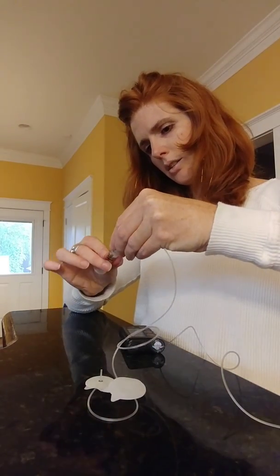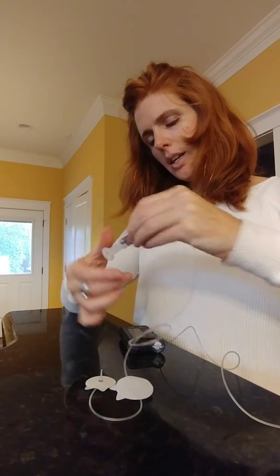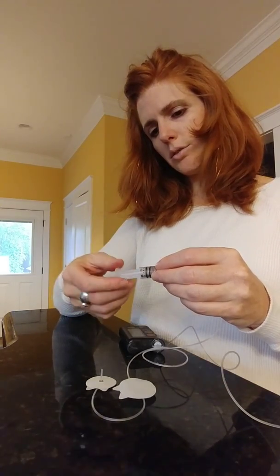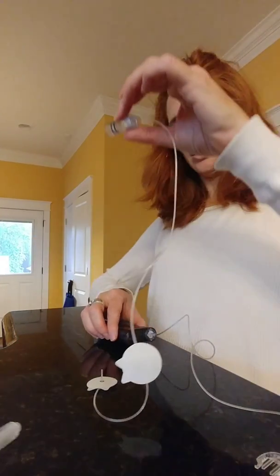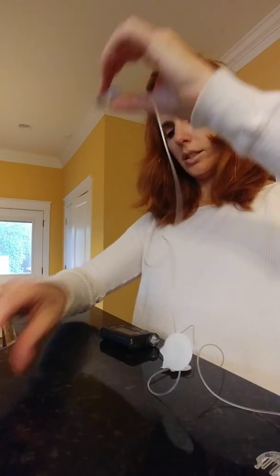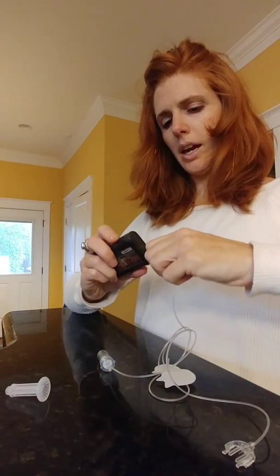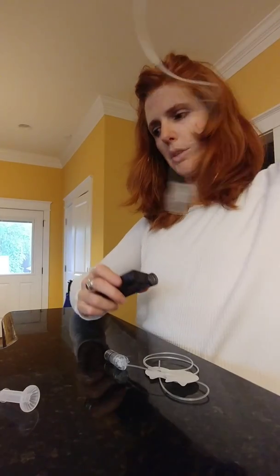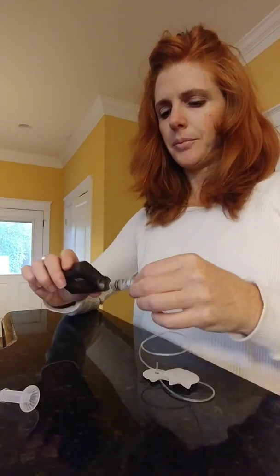And then I place the cap on, and I very carefully unscrew the plunger. I'm trying not to pull back while I unscrew, or else I'll get air in there. So now I have everything connected, and I'm going to unscrew the cap of the old insulin, and I'm going to make sure I put the old one far away so that I don't confuse it with the new one.